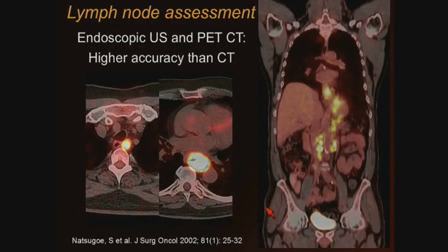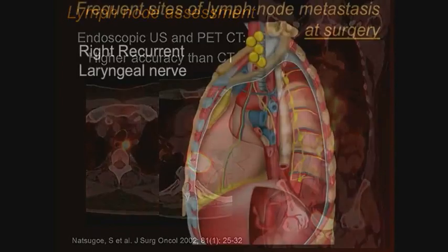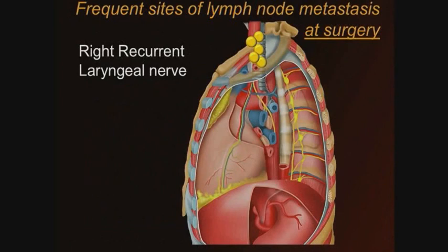And here we're aware of the limitations of CT for defining pathologic lymphadenopathy. We fortunately have endoscopic ultrasound and PET-CT, which have demonstrated a higher accuracy for these purposes, and we can use them for defining which lymph nodes are involved. But how can we add value to our report if we're staging these patients for the first time?